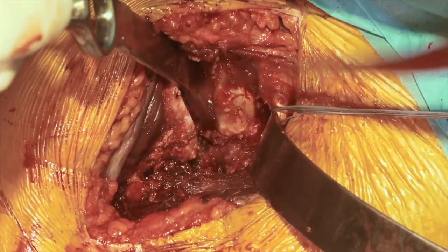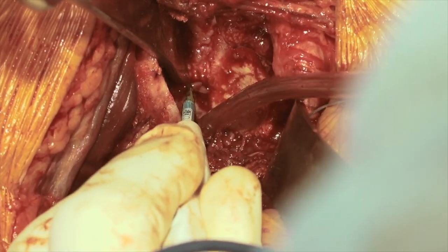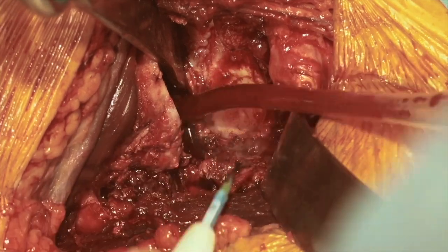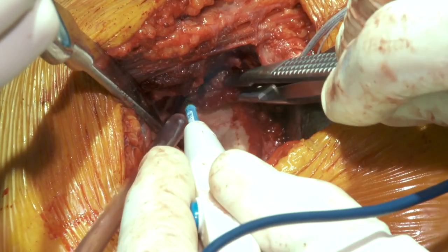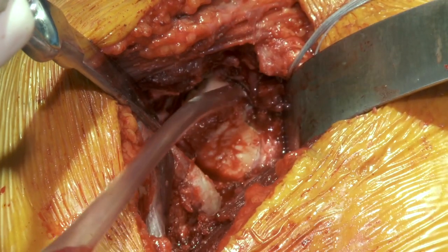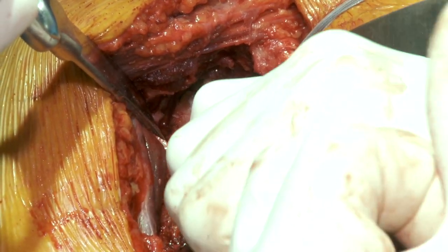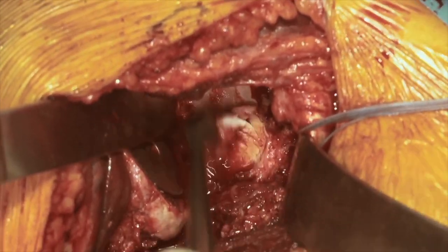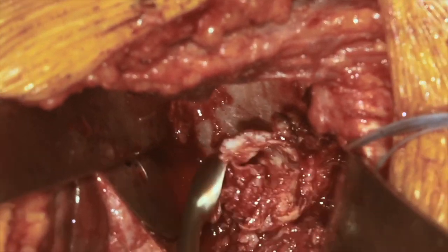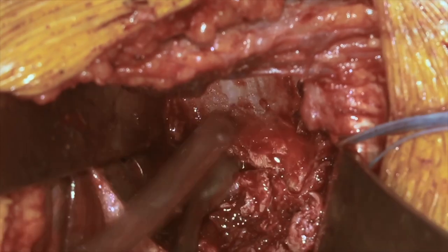We'll internally rotate and release the inferior and posterior capsule to give a little more translation posteriorly, staying right on the glenoid rim. This is particularly important in patients who have had previous rotator cuff surgery, as this capsule can be very tight. For reverse arthroplasty, most of our focus is on the lower two-thirds of the glenoid. We'll take a large curette and remove the soft tissue remaining on our glenoid and scrape off the cartilage. With failed rotator cuff disease, it's not unusual to have a fair amount of cartilage, and we'd like to clean that off to identify the true bony landmarks of our glenoid.